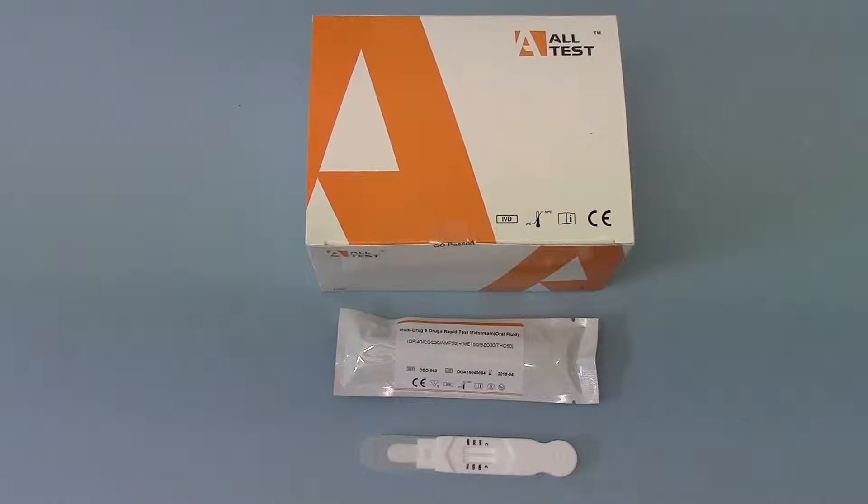Welcome to this product demonstration video where we're going to show you the new Altest DSD-863, which is a direct saliva — or midstream, we like to call it direct saliva — drug testing kit. We think this design is really going to prove popular because of its ease of operation. There's literally absolutely nothing to go wrong with the procedure in running one of these tests on an individual, short of them having an absolutely dry mouth and no saliva available at all.